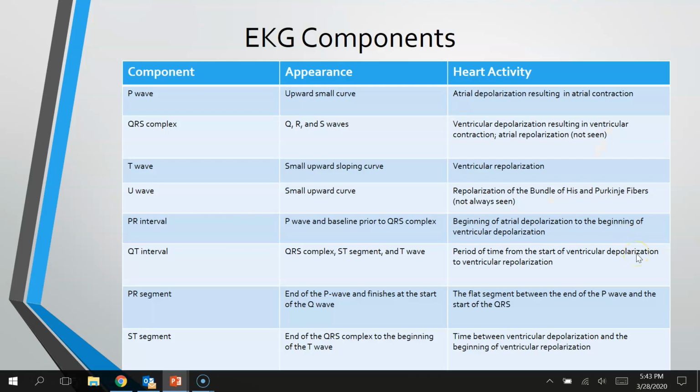So this is a handy dandy little chart that's really nice. It just tells you what the component is, the P wave, the QRS, the segments, intervals. It tells you what you should be seeing, and then what the heart is doing. Is it depolarizing? Is it repolarizing? You know, what may be going on there.